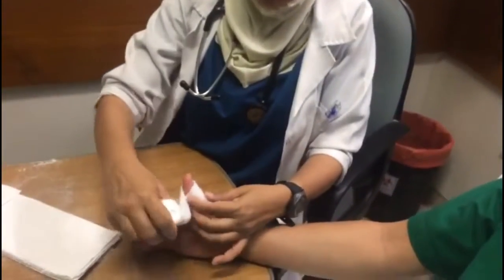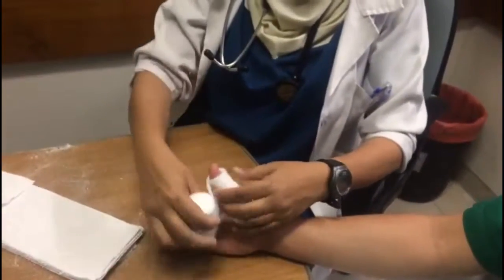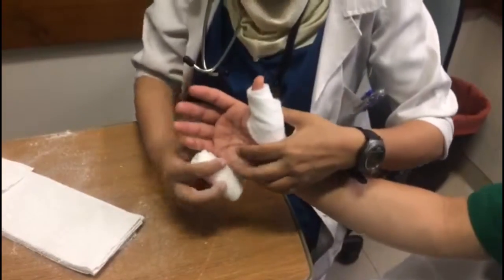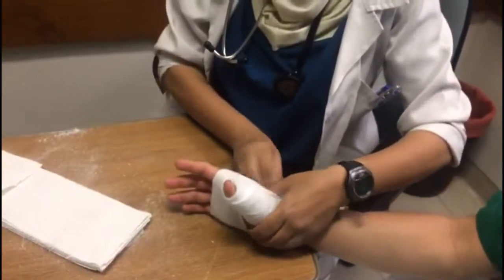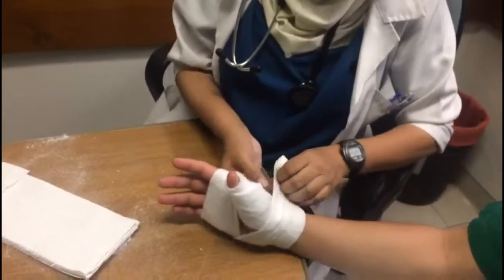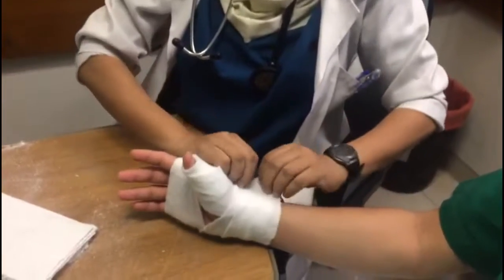The wrist should be in slight extension, approximately 20 degrees, with the thumb in functional position. Don't use too much padding — keep extra padding on the bony prominences like the wrist. Then wrap the soft roll at 50 percent overlap as you go up.